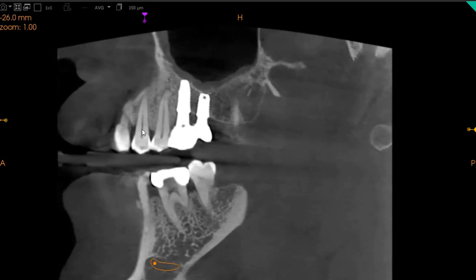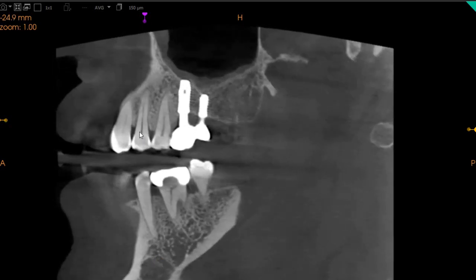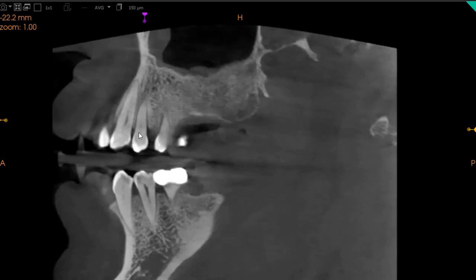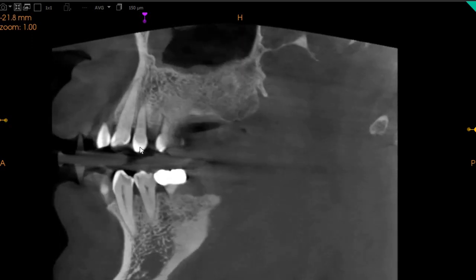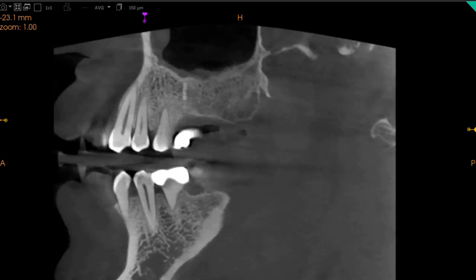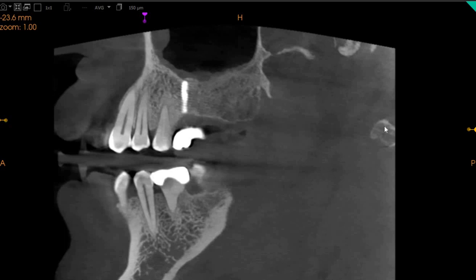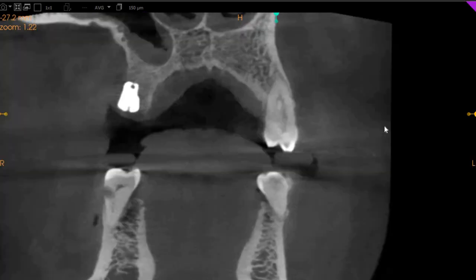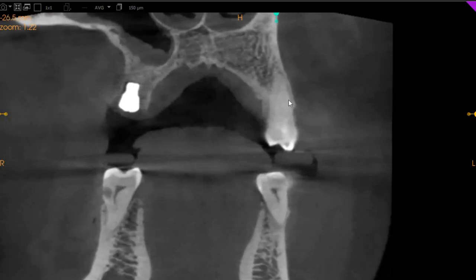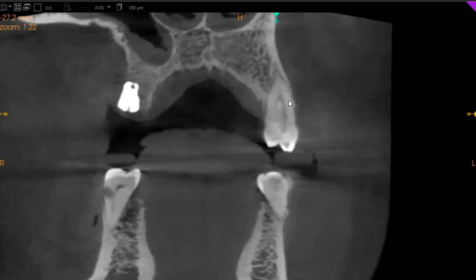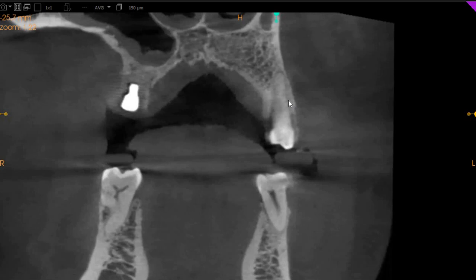On the sagittal view, we don't see any significant fracture lines, we don't see any cracks, and we don't see any J-shaped radiolucencies or any furcal bone loss associated with these teeth. The coronal view, which is the front-to-back view — here you can see that this is the upper left four.